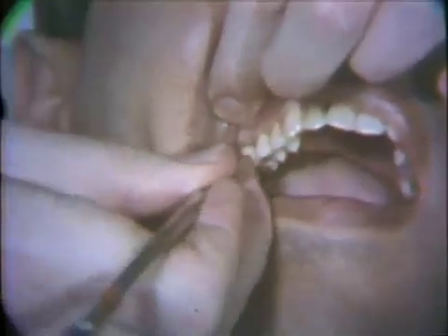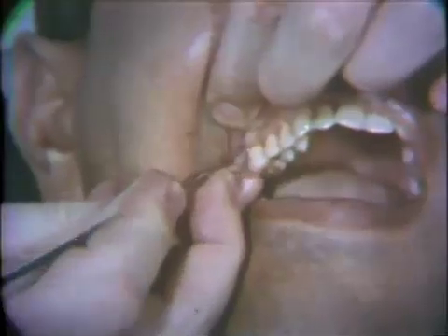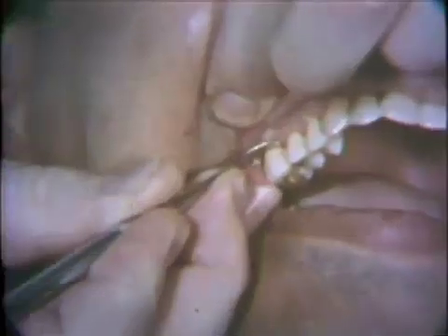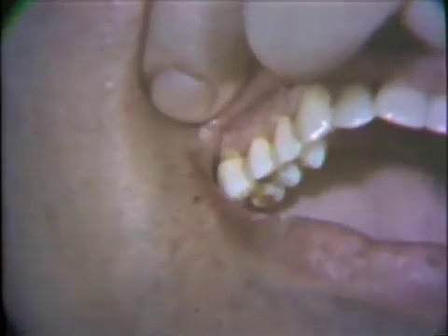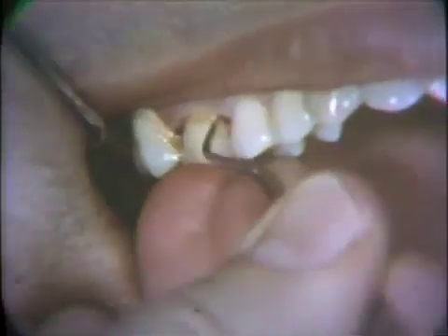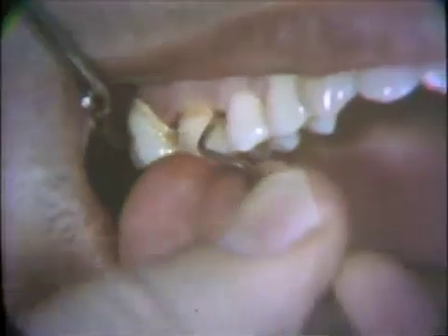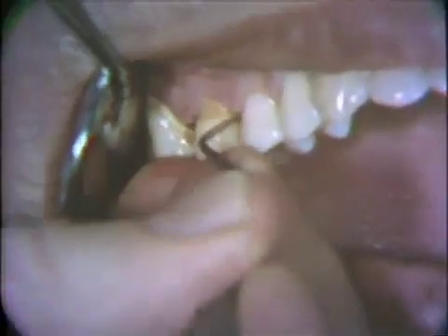The curette is the most versatile instrument for scaling teeth and should be used wherever access for it can be gained. Scaling is performed with short, deliberate strokes while maintaining a definite finger rest. The scaler is periodically dipped in iodine lotion during the procedure.